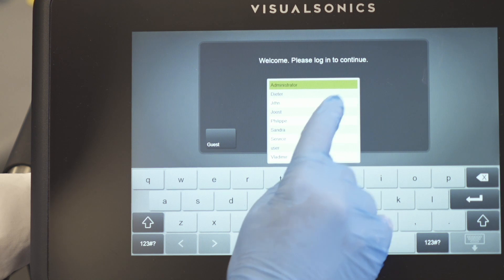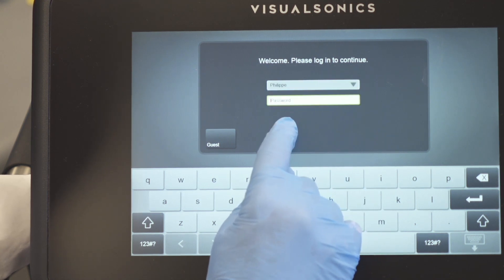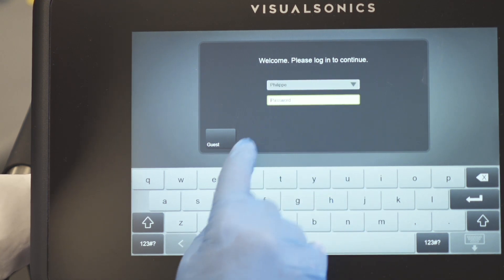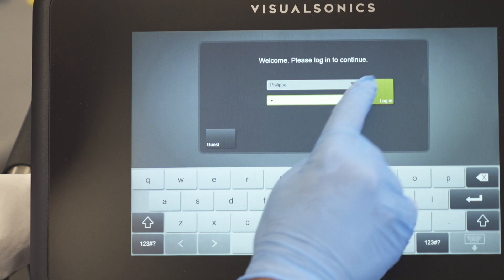On startup, you can customize the software interface. Each user can have their own account with their personal settings.